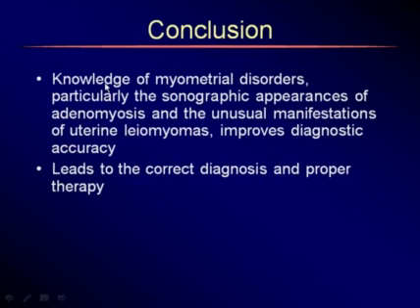So I hope that I've given you a spectrum of various myometrial disorders, especially focusing on adenomyosis and unusual manifestations of uterine fibroids. Hopefully this will improve your diagnostic accuracy and lead to the correct diagnosis and subsequently the proper management of your patient.